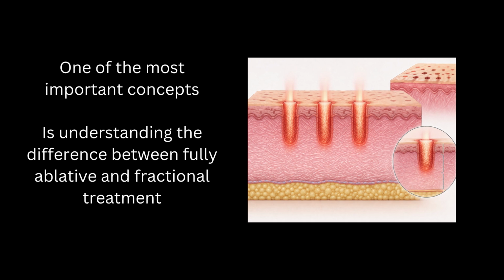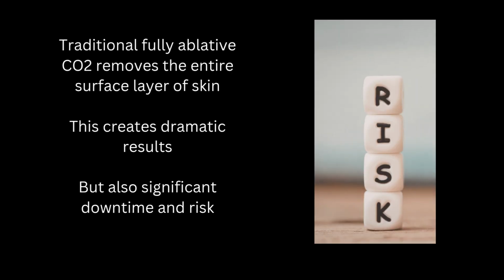One of the most important concepts is understanding the difference between fully ablative and fractional treatment. Traditional fully ablative CO2 removes the entire surface layer of skin. This creates dramatic results, but also significant downtime and risk.